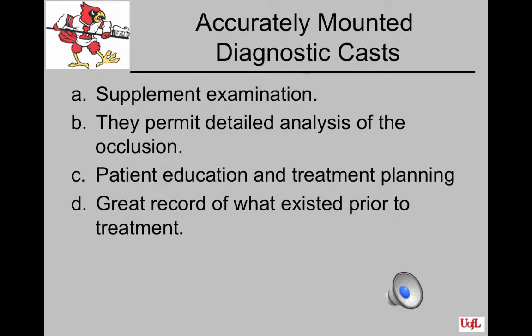and if you're doing some major reconstruction, it's very necessary that you keep these diagnostic casts in case a conflict occurs and even something so severe as litigation. You have evidence of what you had when you start.